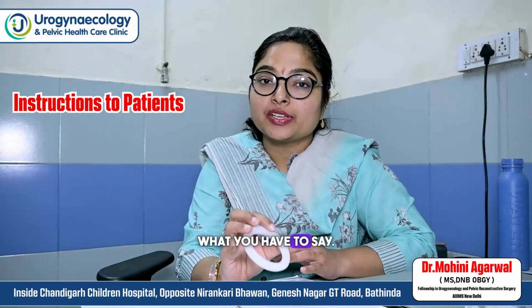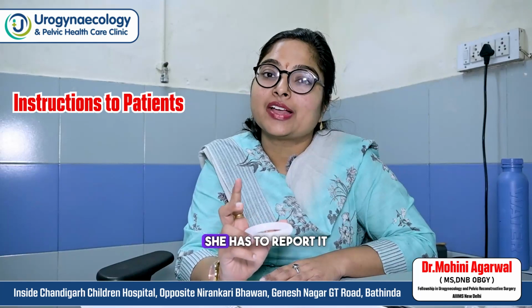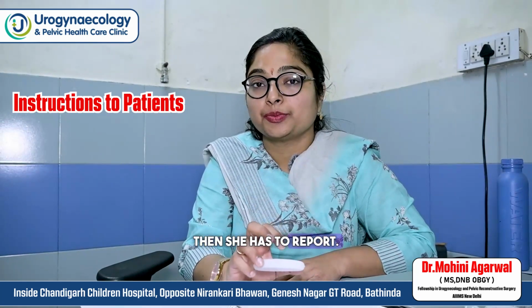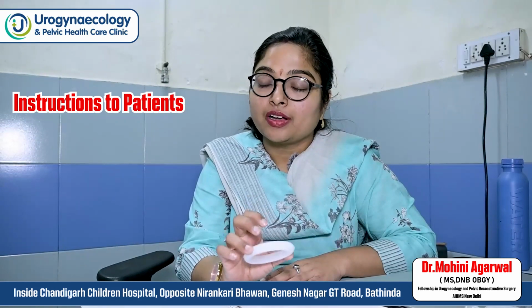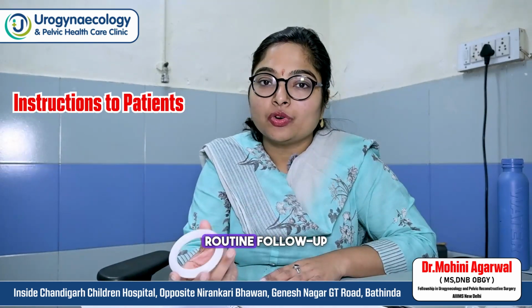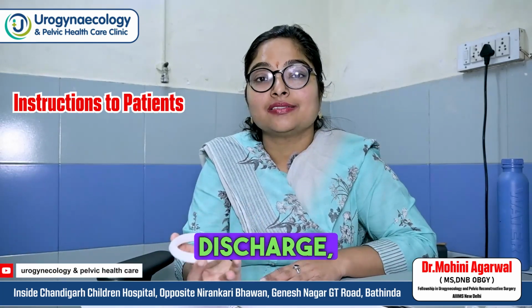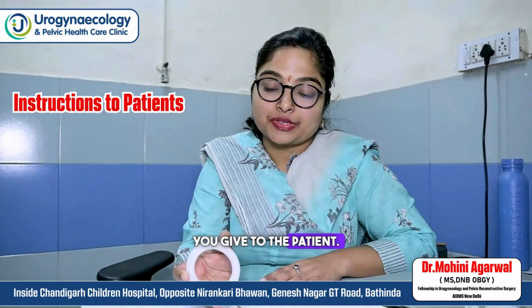Some signs what you have to say. If the pessary falls out, there is nothing to worry. Discharge will increase, nothing to worry. But after going home, if she is having pain, she has to report it immediately. If she has difficulty in voiding, then she has to report. If it falls out, she can come for the routine follow-up whenever she is dated, and discharge also. But if there is foul smelling discharge, then also she has to report immediately. These are the instructions you give to the patient.